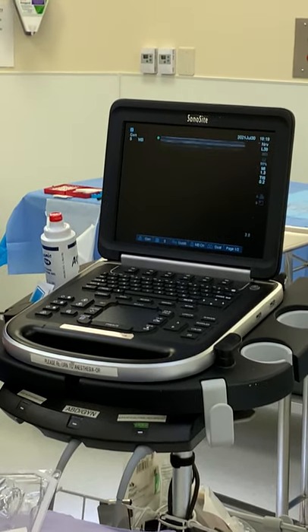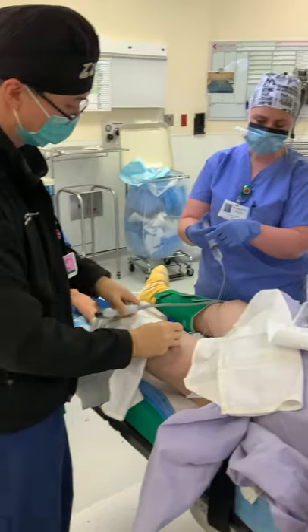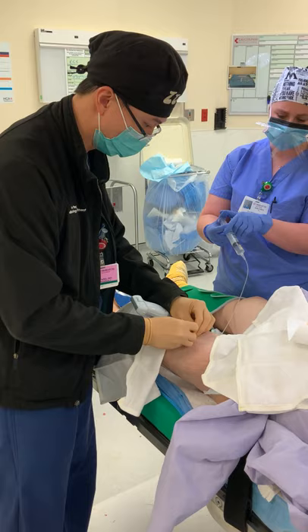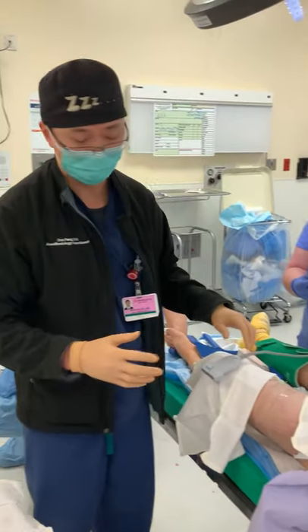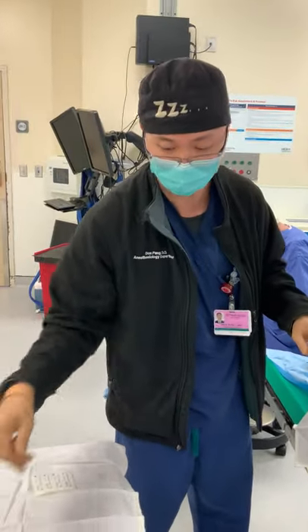I'm happy with where this is. Go ahead and give me a few more cc's. I'm going to put some in there just to get the position confirmed. I'm going to secure this. Now we're going to clean up all that ultrasound jelly and then affix the adhesive onto the patient's skin.